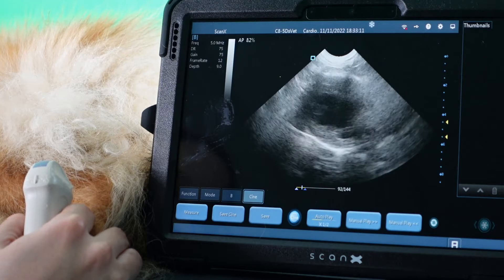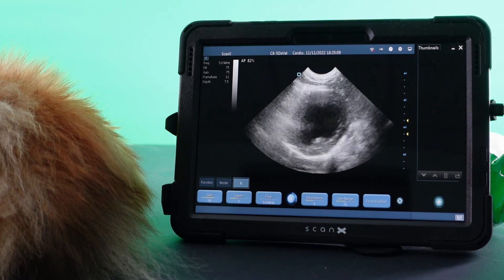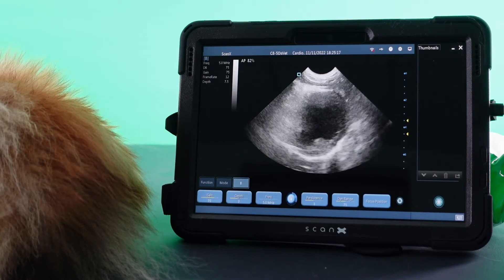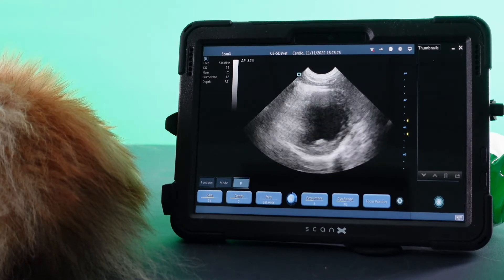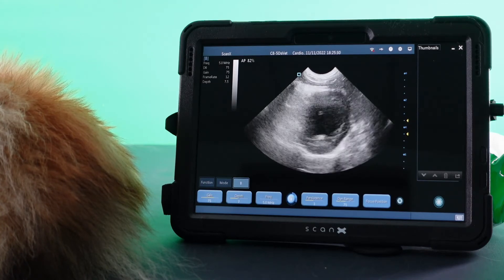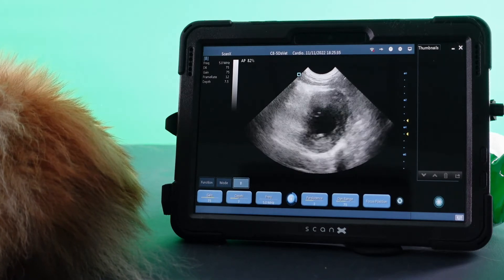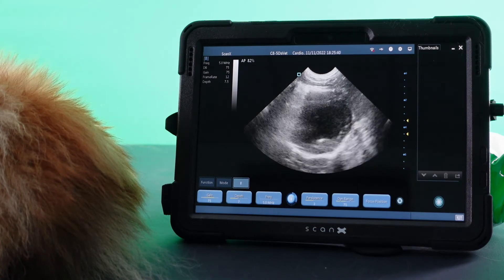To unfreeze your image, make sure you click and drag the freeze button. Other things you could do from this view are tilt up towards the base of the heart to get a subjective idea of LA:Ao ratio — the ratio of the aorta to the left atrium. You could do the same from your right parasternal long axis view, comparing the left atrium to other chambers and structures in the heart. In Doppler's case that's always going to be abnormal — she does have congenital heart disease — so I'm not going to do that with her. I'm going to turn her over to the other side to see if we can get any apical views.